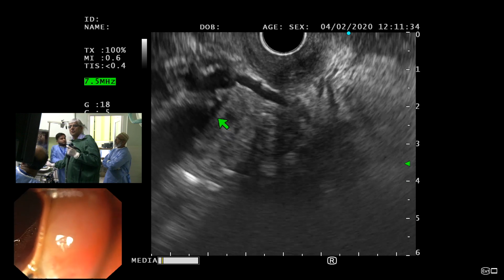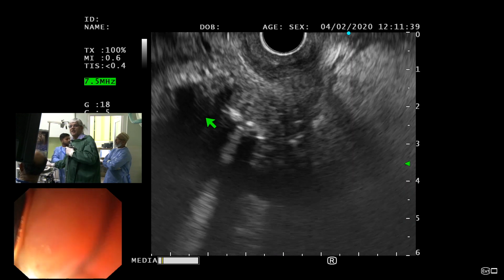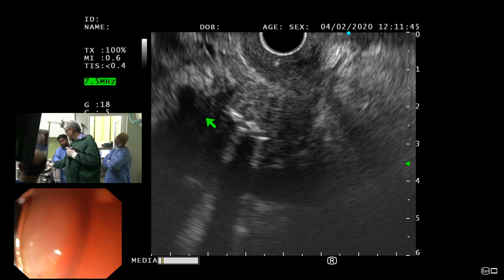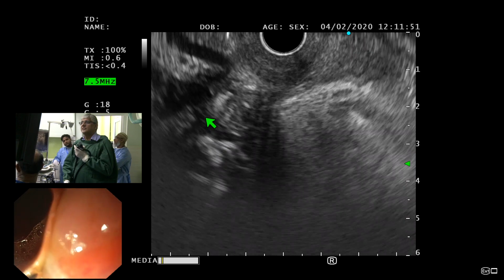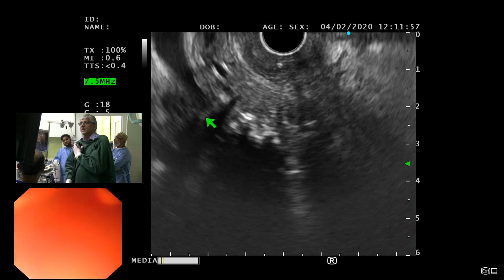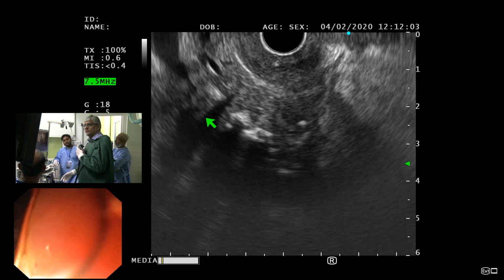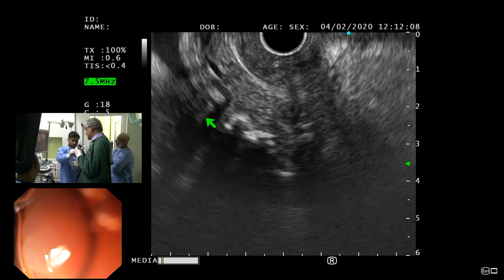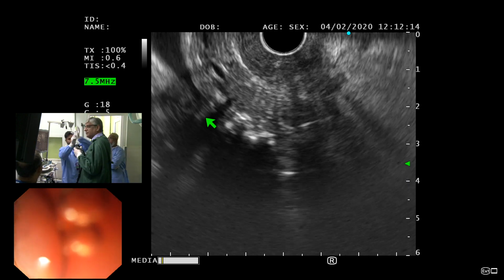And the tail is gone, so that's the only explanation I have. I tried looking for it, I can't see it. If it was dilated, you don't have to find it. Dilated pancreatic ducts are easy to see, in fact they come and shout at you themselves. It's when they are not dilated that you struggle to find them. So this is what I feel. Riyaz, do you agree? This is the only area that I find abnormal. Yeah, that's the only area that we can say is abnormal. I can't go beyond, so we are stuck in this sense that this is the only place we have. So are you going to do FNB? I am going for FNB.